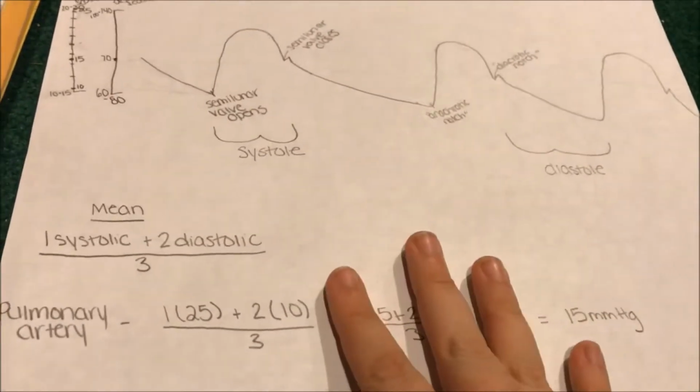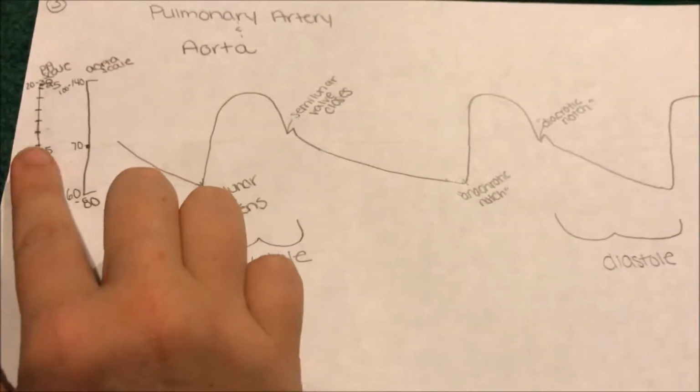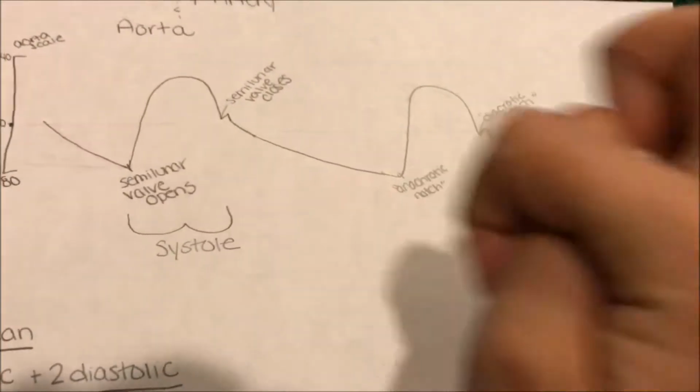And that works out perfectly because when we talked about it before, we said the mean of the pulmonary artery is typically 10 to 20, and 15 fits right in there. So if you drew a dotted line, which I sort of did, you can kind of see it. If you drew a dotted line at 15, it should be right in the middle of the waveform. The same amount on top, the same amount on bottom.